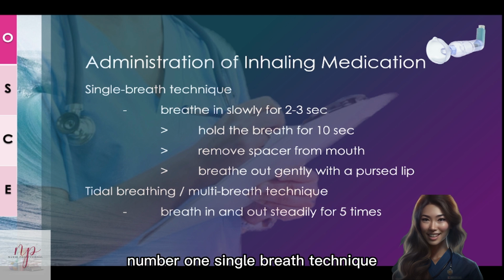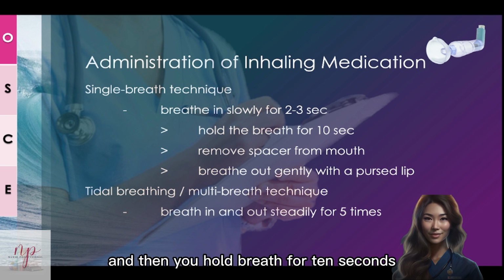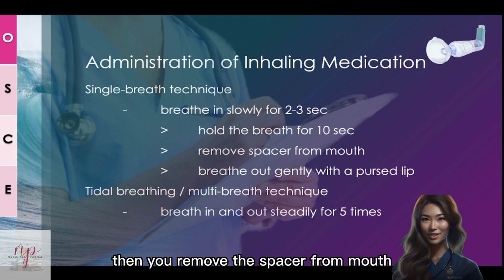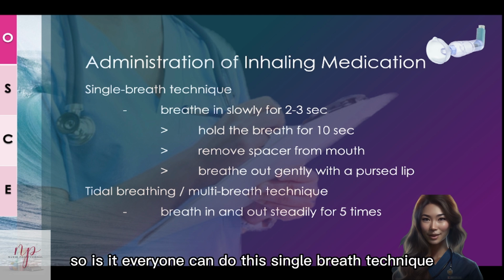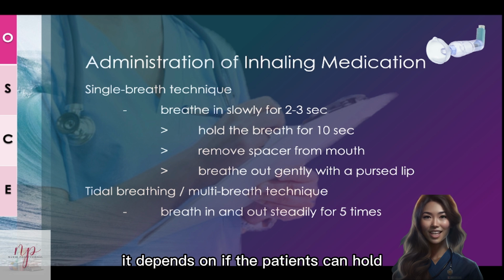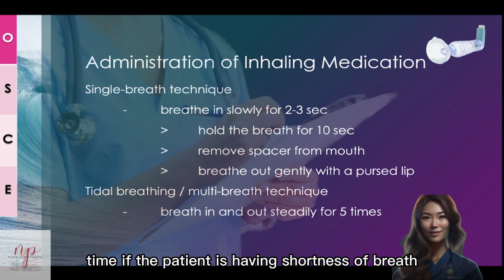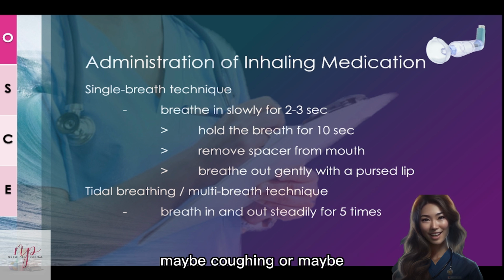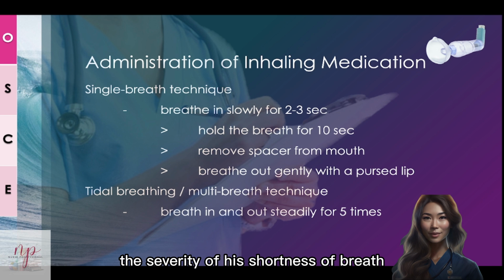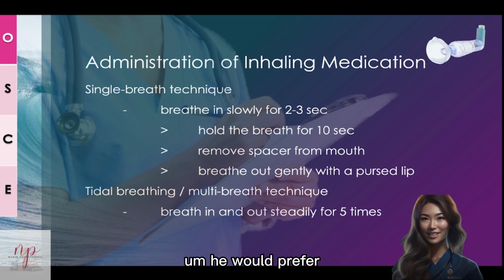Number 1, single breath technique. You need to breathe in slowly for 2 to 3 seconds, and then you hold the breath for 10 seconds. And then you remove the spacer from the mouth, and then you breathe out gently with pursed lips. So, can everyone do this single breath technique? It depends on whether the patient can hold the breath for 10 seconds. It could be a relatively long time if the patient is having shortness of breath. So actually you could observe the patient's coughing or the severity of his shortness of breath, or you can ask the patient to choose which one he would prefer.